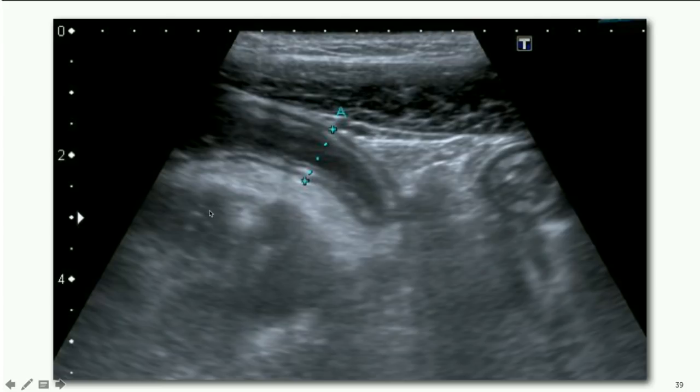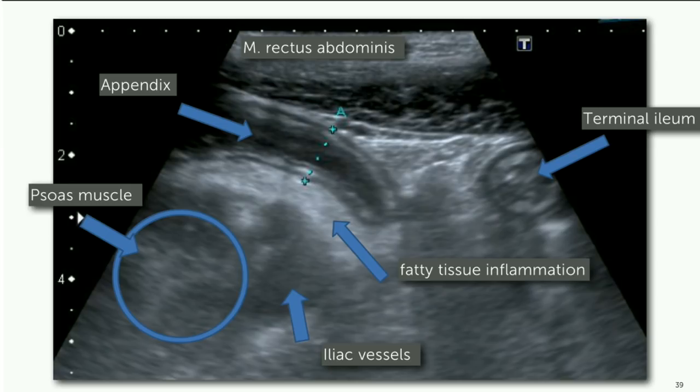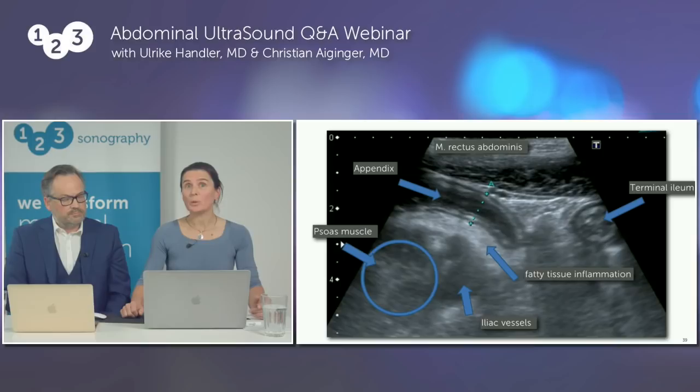The landmarks are visible: abdominal wall, psoas muscle, iliac vessels, and this dilated appendix. When we diagnose appendicitis with these findings we can be sure, but finding a healthy appendix is not always possible — in many cases we cannot visualize it. Appendicitis is a diagnosis combining clinical findings, lab tests, and imaging methods like ultrasound.